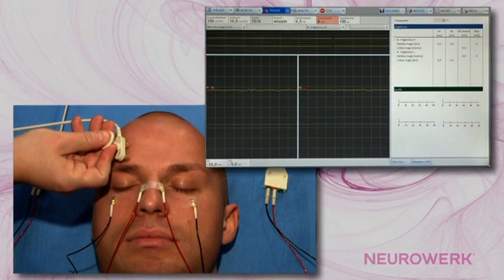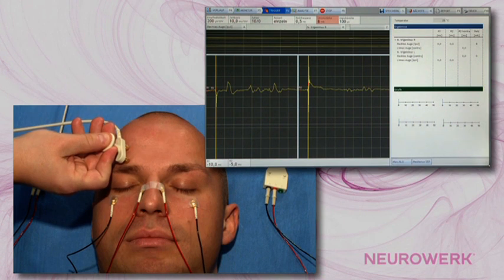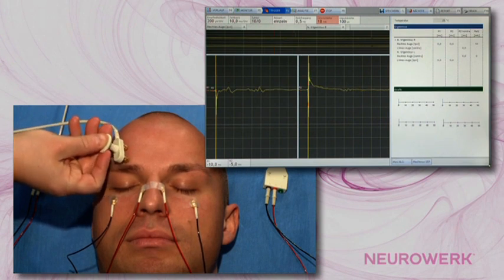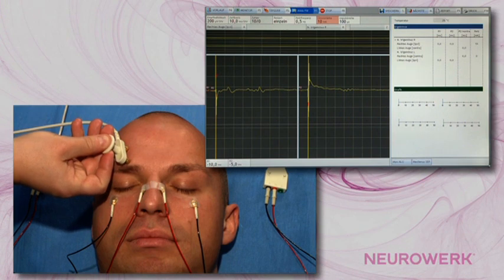Since the reflex habituates very quickly, the stimulation should occur very slowly and not in a rhythmical manner, and possibly no more than once every 10 seconds. In addition, the stimulus should not be pre-announced. Stable reflex responses may be expected with stimulus intensities between 10 and 20 milliampere.